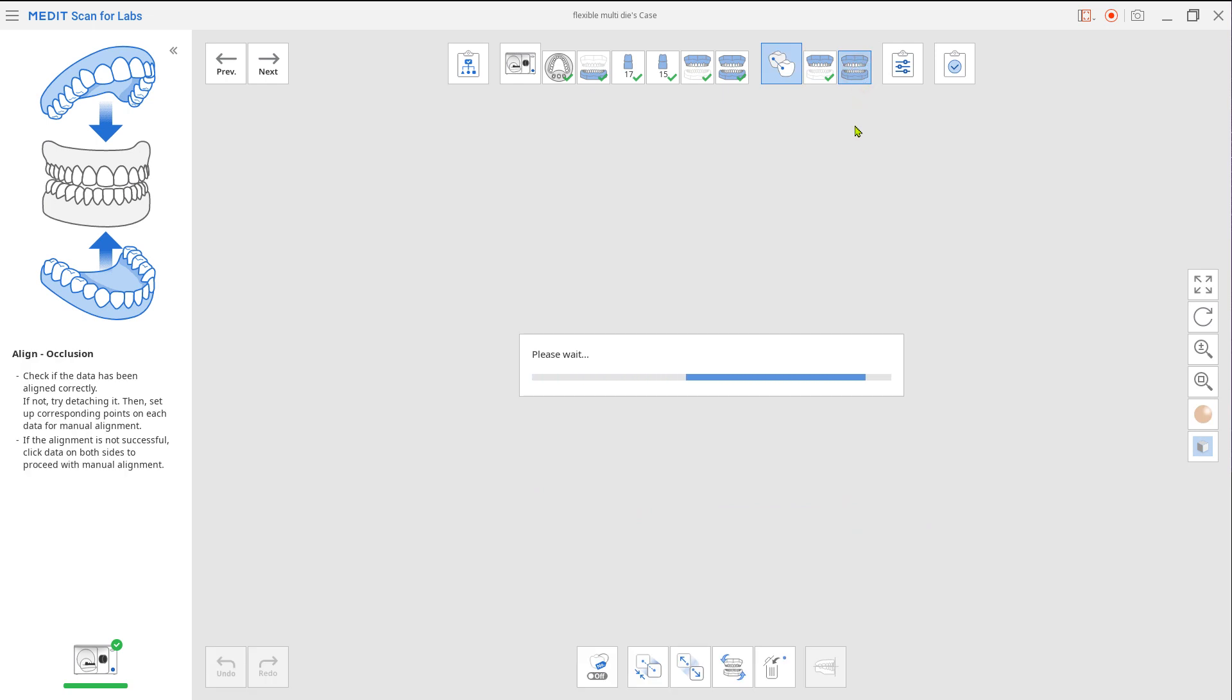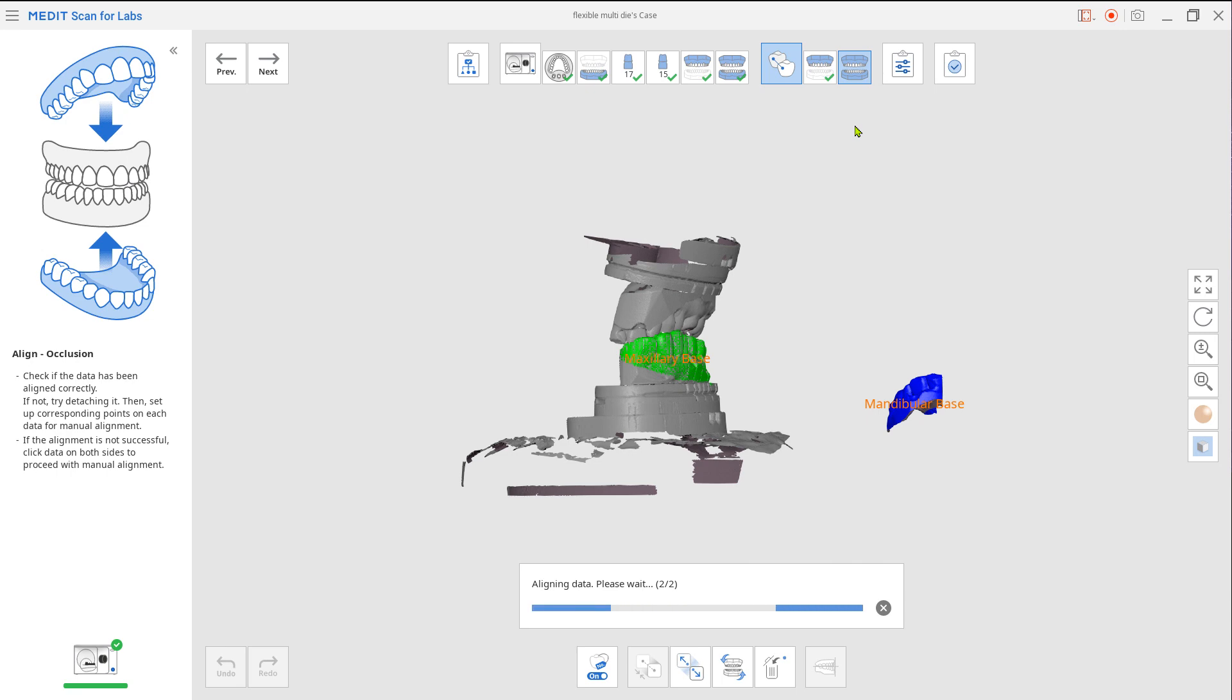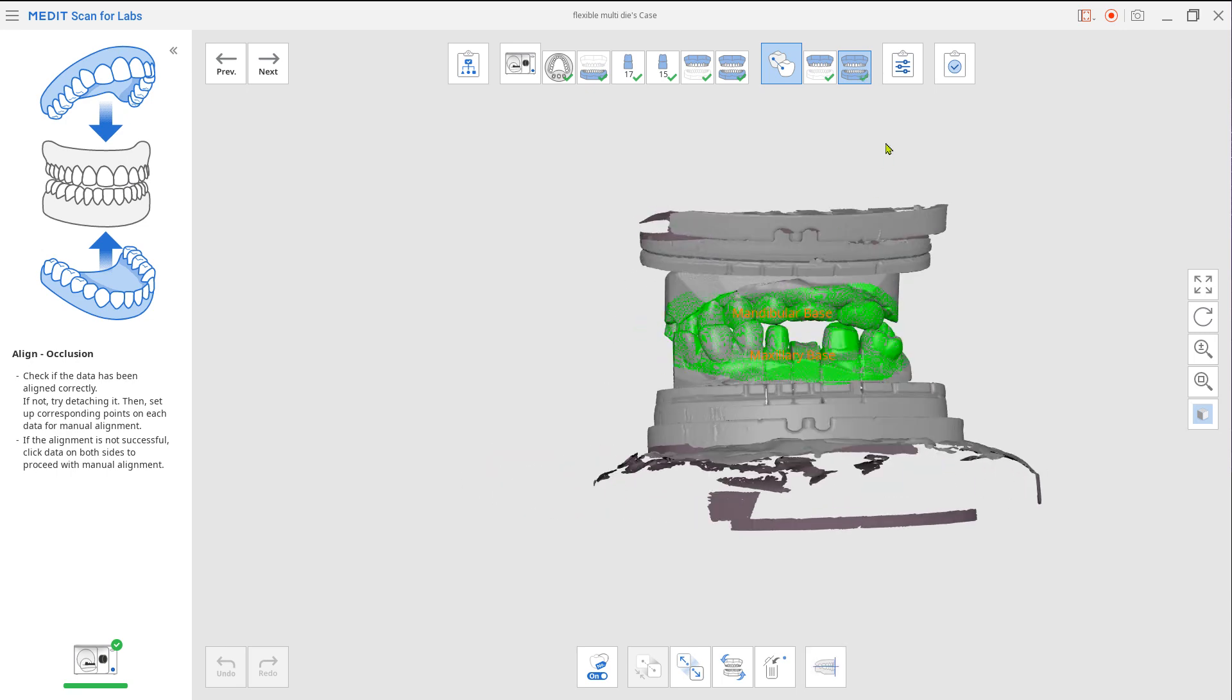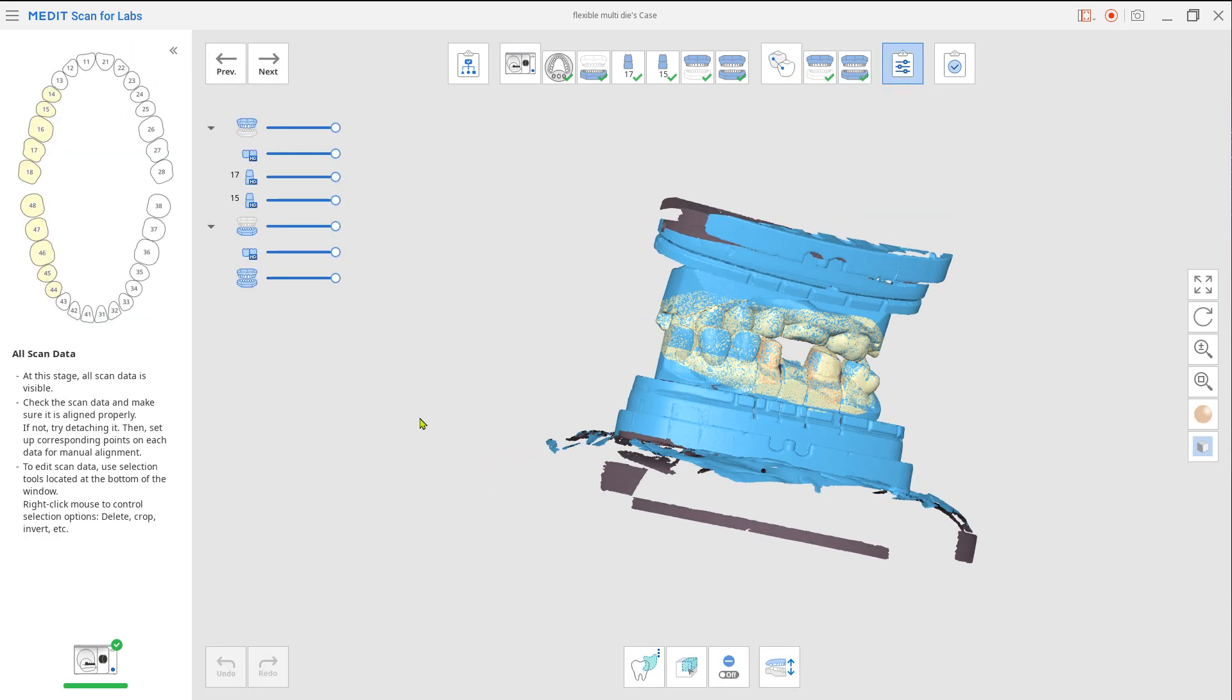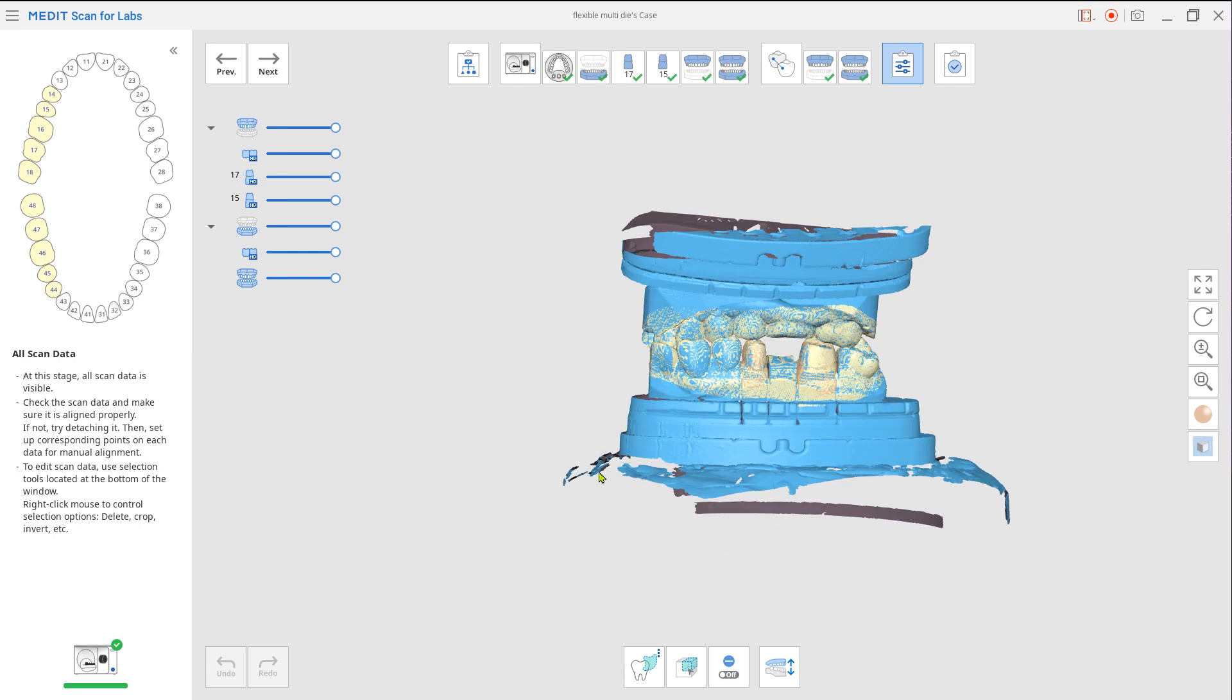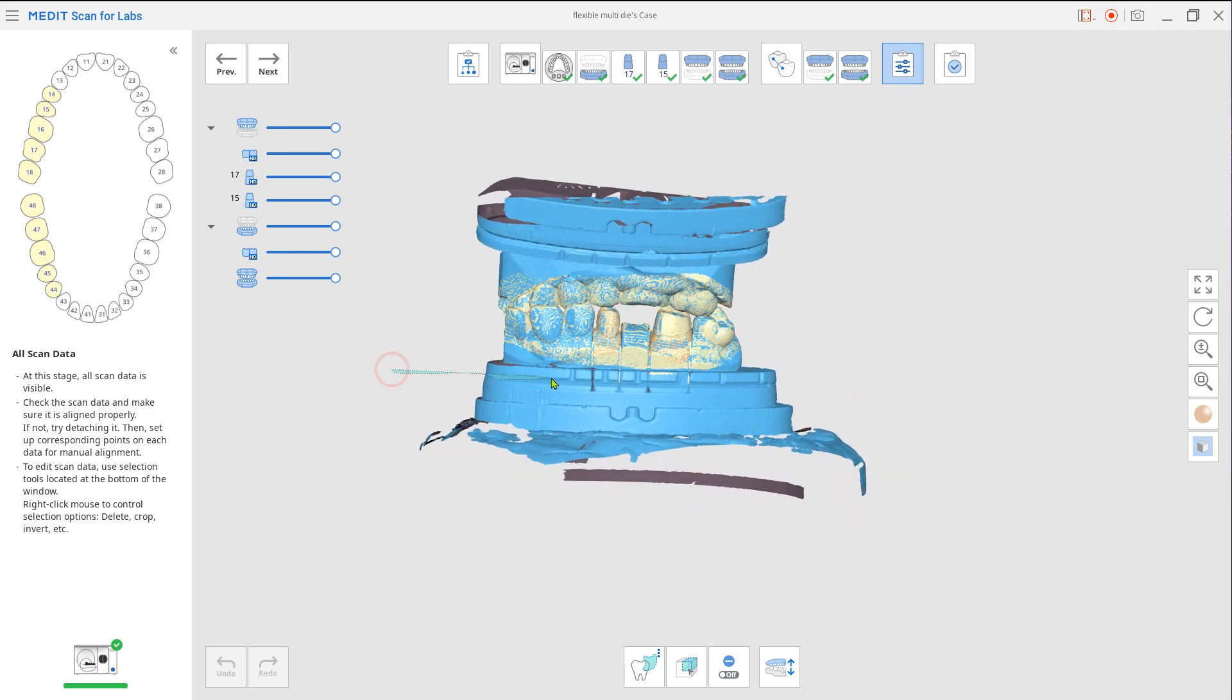Now go to the occlusion alignment. The system will automatically assign both the upper and the lower occlusion. Go to Confirm to make any final adjustments. Otherwise, click Complete to exit.